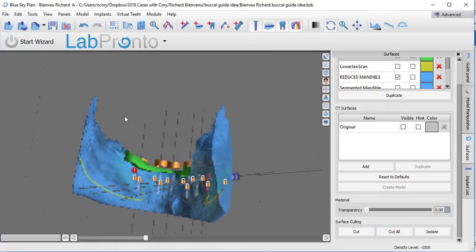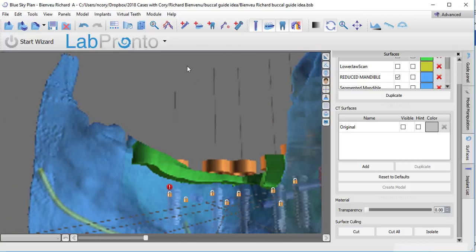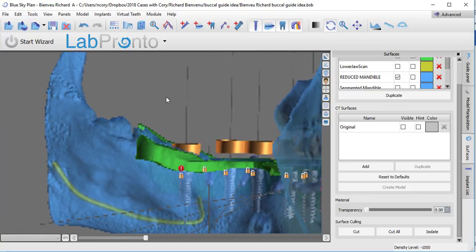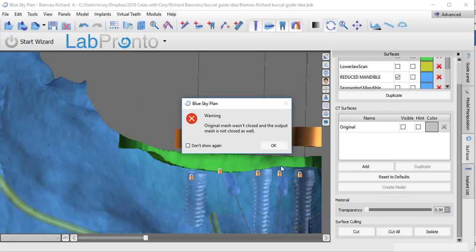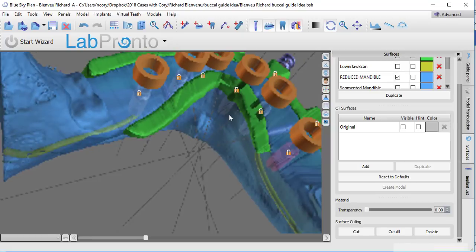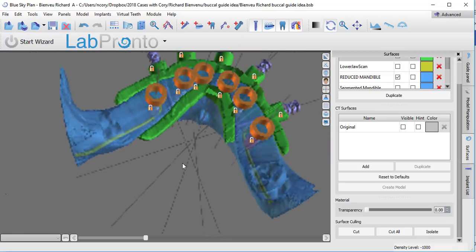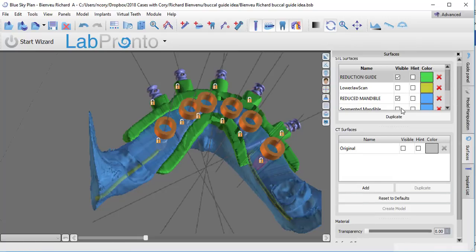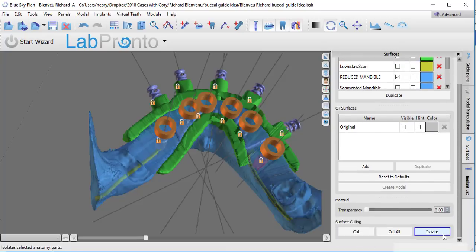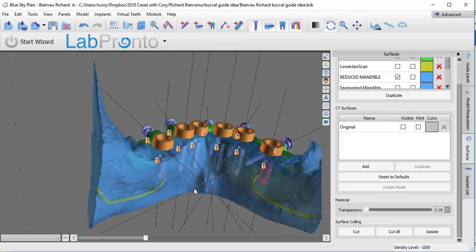And while we're at it, let's just go ahead and do one more back here by the third molar, just for good measure. Okay, I was a little premature there, so now we're really done with this. You do still have the lingual portion floating out here, so let's come up here to our objects browser and let's just click on the green reduction guide. And then if you go to the bottom, you'll see a button that says isolate. So I'm going to click on the part that I want to isolate, and that's going to make everything not touching this buccal guide disappear now.